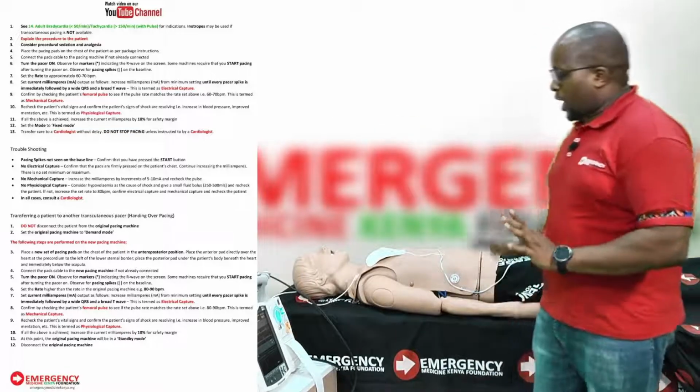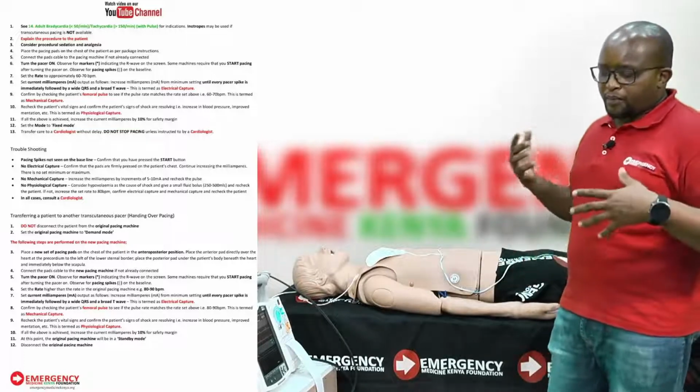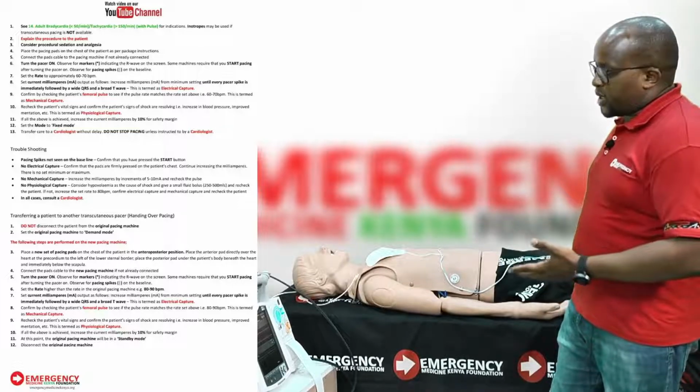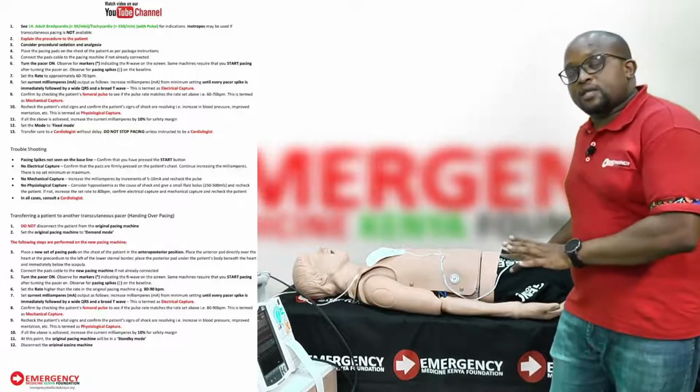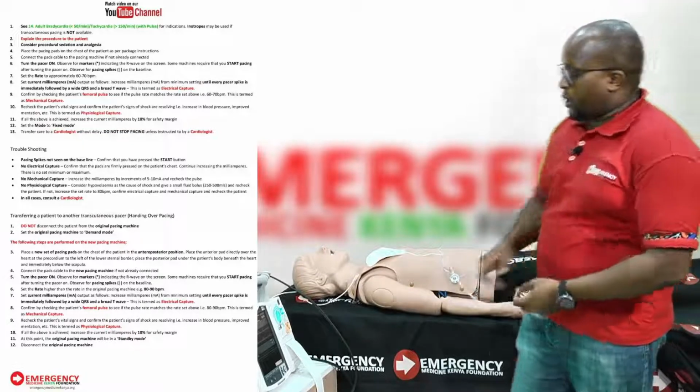So the first thing, of course, I have my patient, I've confirmed the rhythm, I have ruled out any potential metabolic or electrolyte causes that could be causing this low heart rate. I have determined my patient's blood pressure is a bit low. So what I'm going to do is initiate them on pacing.